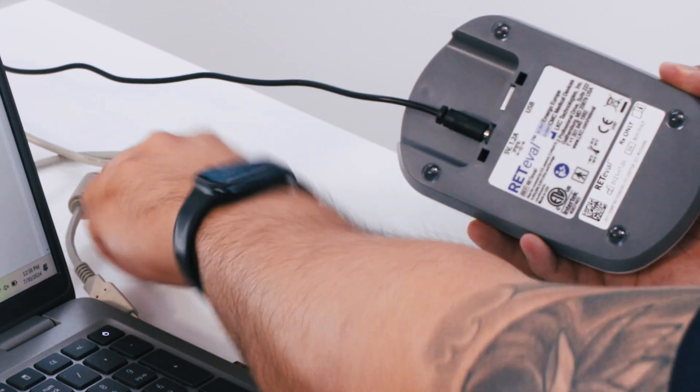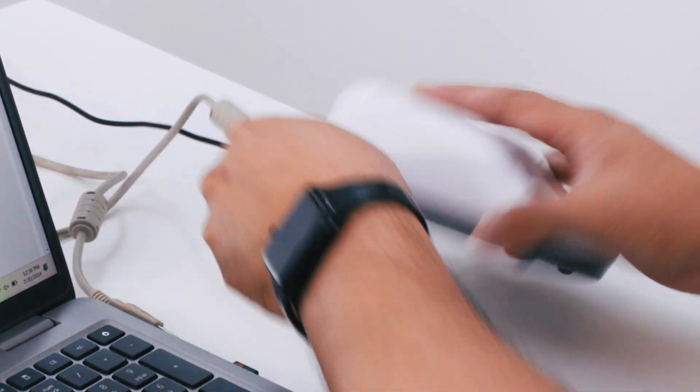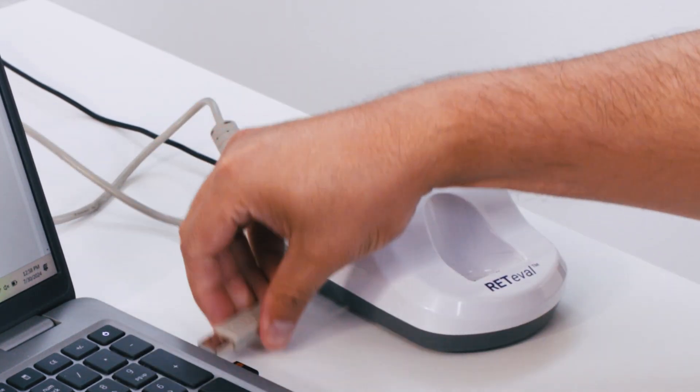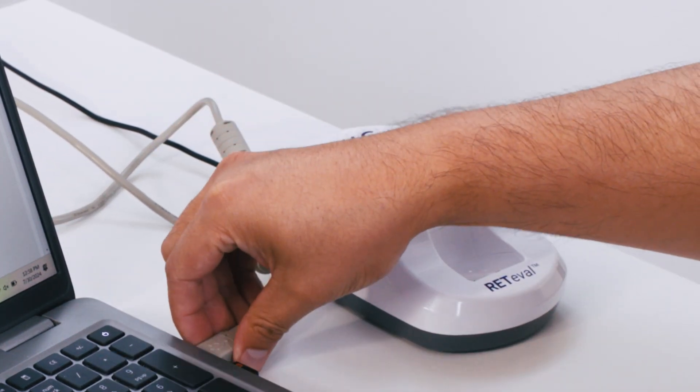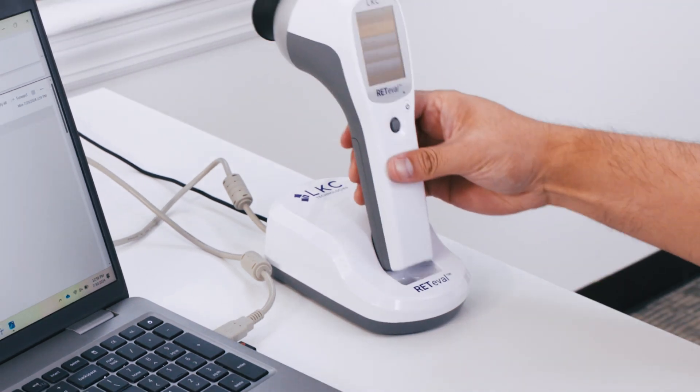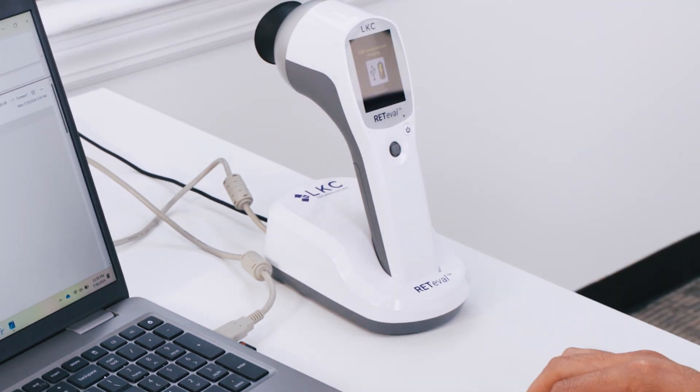Plug the gray USB cable into the computer that you use for your RETeval device and reports. Then place your RETeval device into the docking station.